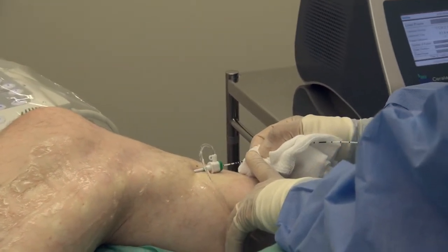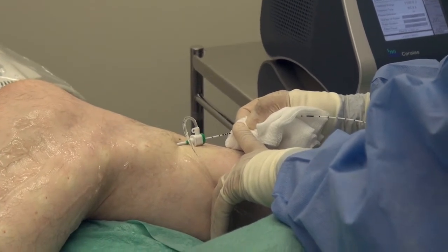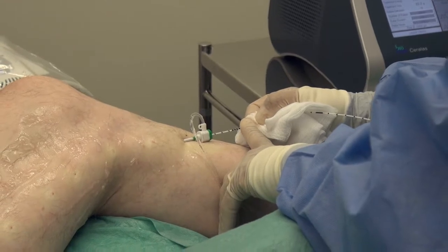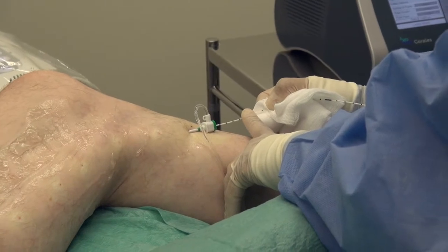By a simple calculation — dividing the total amount of energy delivered by the length of vein treated — we can calculate the number of joules of energy delivered to each centimetre of vein.